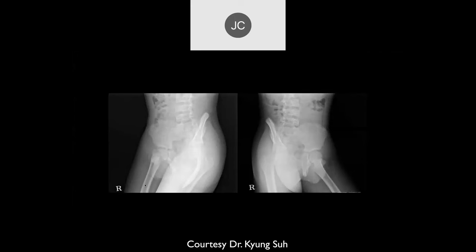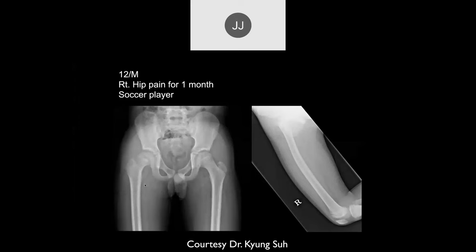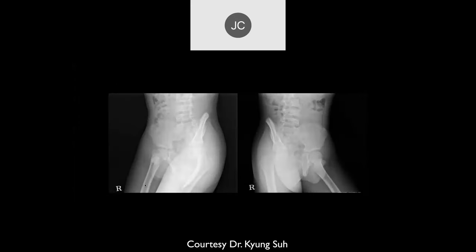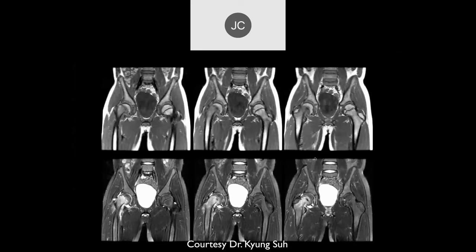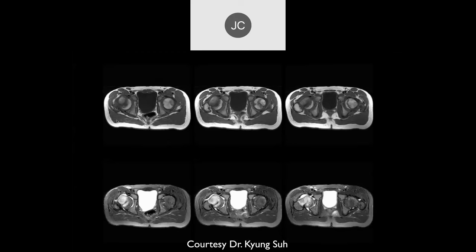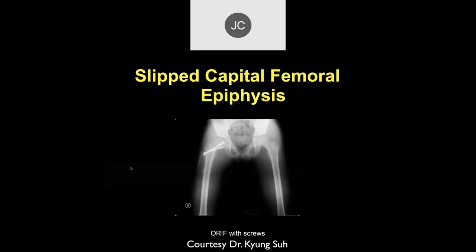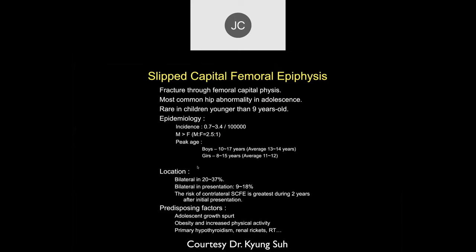How old was this patient? Twelve. That's about right — soccer player. On the obliques we can see the SCFE and the normal side. Here's the MR scan. With MR, we also see edema within the bone, slipped capital femoral epiphysis, edema on either side of the growth plate. Further examples in the axial plane of the slippage. It was fixed by two screws — the fixation looks good.